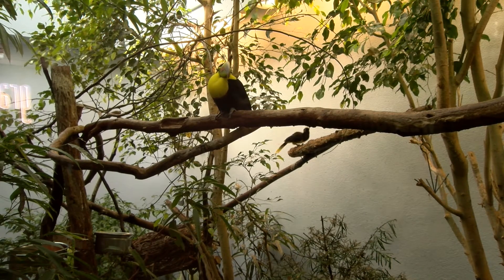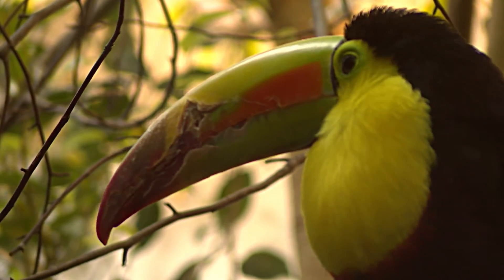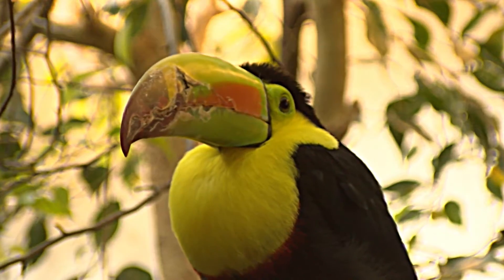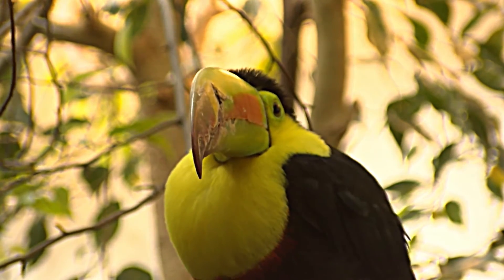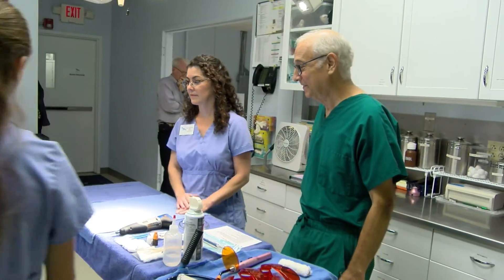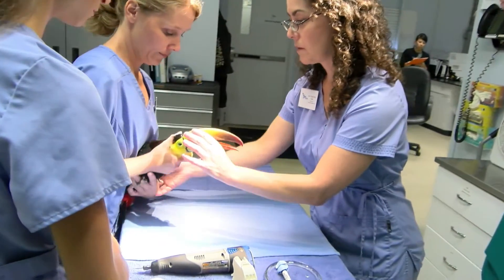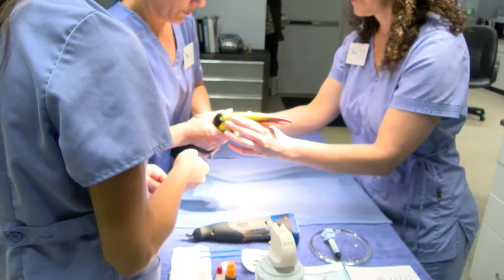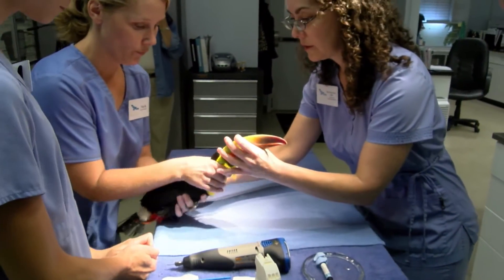A keel-bill toucan at the National Aviary suffered a beak injury that was impairing his ability to eat. Pediatric dentist Mark Pacersky stepped in to guide National Aviary Director of Veterinary Medicine Pilar Fish in the use of dental bonding materials and tools typically used in human dentistry treatments.